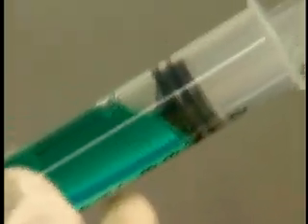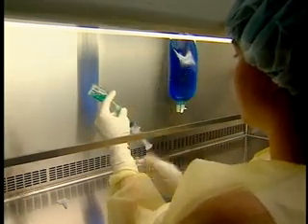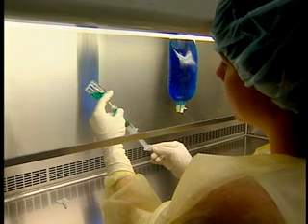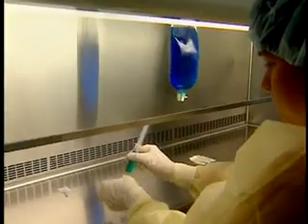Expel the air from the syringe by using one large bubble to capture all the smaller bubbles, then tap the syringe barrel to free the bubble from the rubber plunger. If necessary, draw a little air from the vial to create a bubble. Adjust the volume in the syringe to the desired level. If necessary, return air from the syringe into the vial.